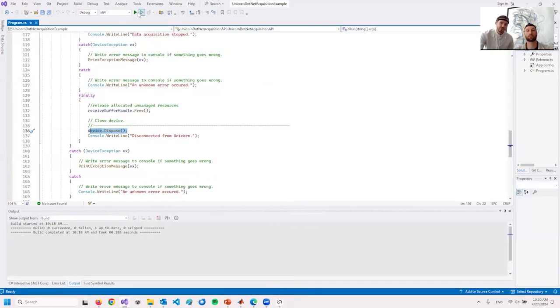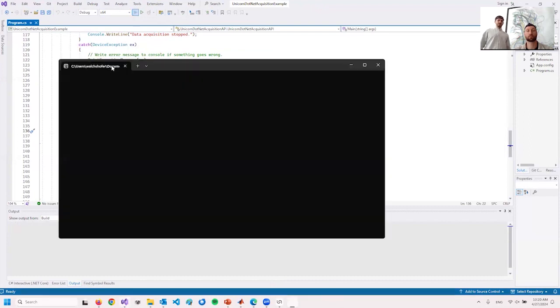That's what you would probably like to integrate in your application if you want to use one of the APIs. They're all following the same principle. No matter if you're using the C#, the C, or the Python API, they all integrate this same strategy.